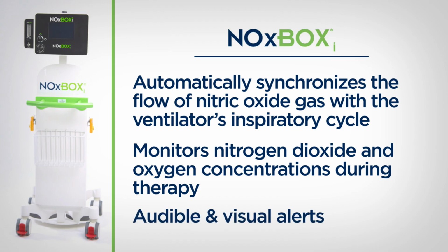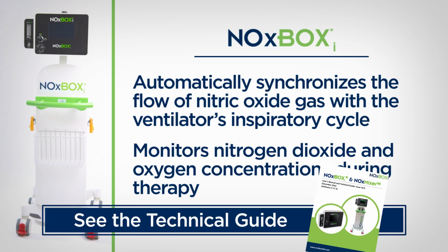The system provides audible and visual alerts for many unexpected operating conditions, including nitric oxide, nitrogen dioxide, or oxygen levels outside of user-selected concentration limits, or whenever the nitric oxide dose setting is changed by the user. Refer to the technical guide for complete details on all alerts.